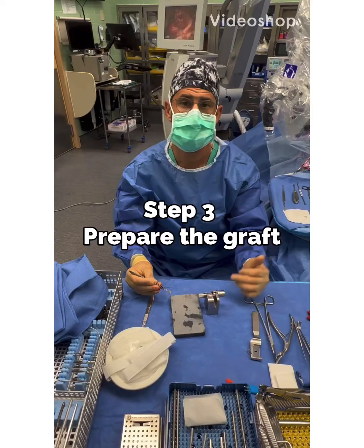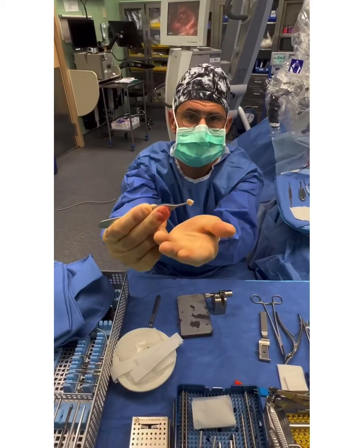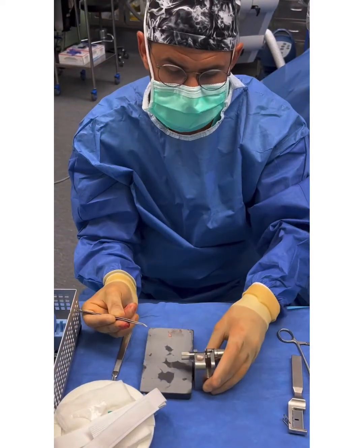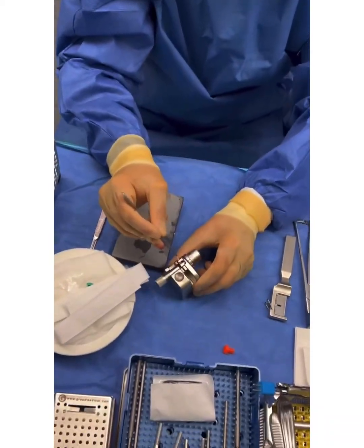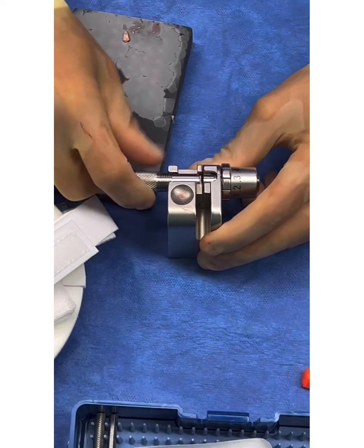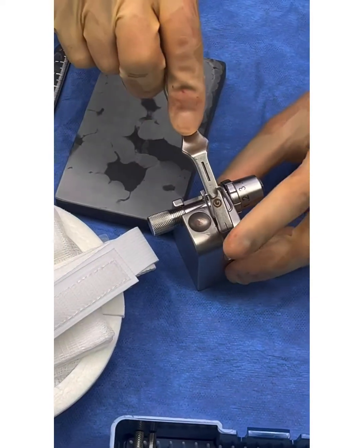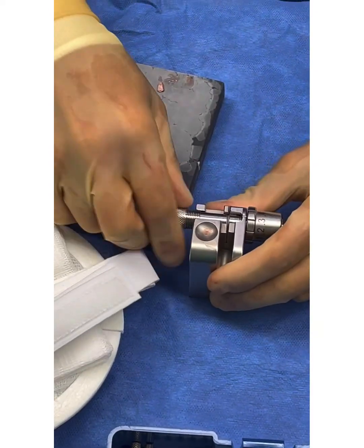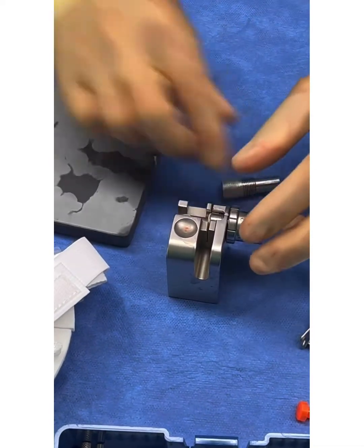We're ready to cut our cartilage that I harvested from the patient's tragus to create a new eardrum. This is our piece of cartilage right here — we're going to put it into a special cartilage cutter. We place it into this device, insert it in, tighten it down to hold it in place, set the thickness of the slices that we want to cut, and like a guillotine — boom.